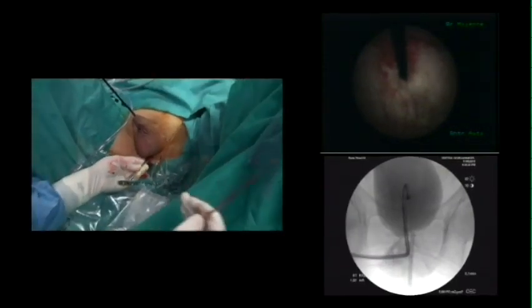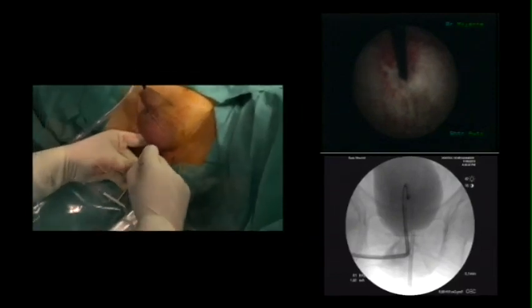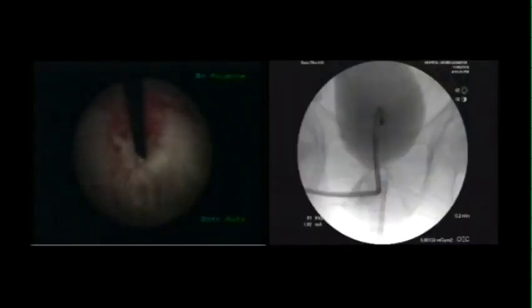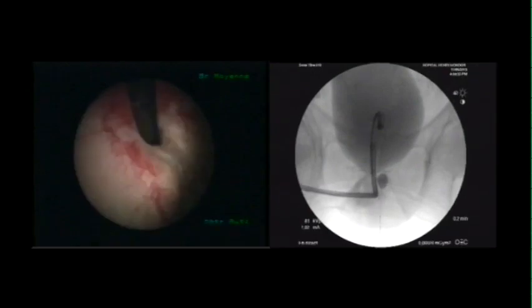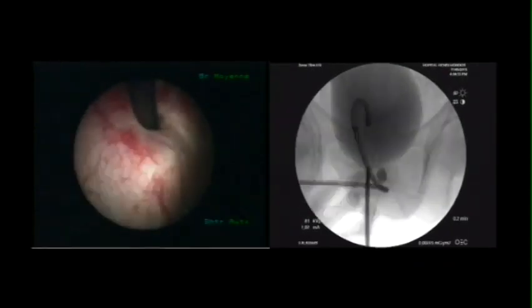After confirming its position, the balloon is filled with one milliliter of isotonic contrast solution. The procedure is then repeated on the contralateral side for the second balloon.